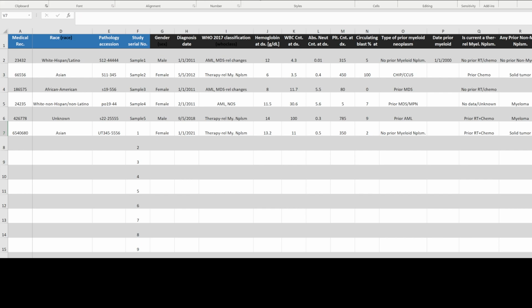And if they did a P53 IHC, in this case they did do it, and if they put a number on the number of strong positives, right? You don't want the rare weak positives, which is the wild type. Strong positives is what we are counting. Let's say there was 45. Sometimes you see a lot more P53 than CD34s.